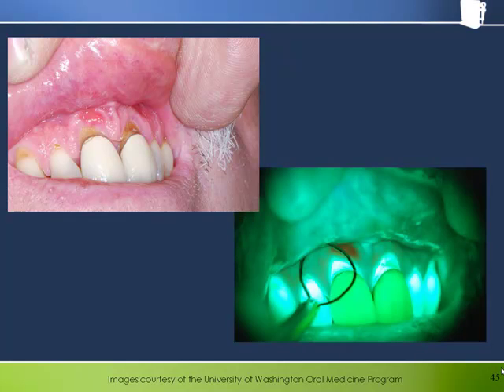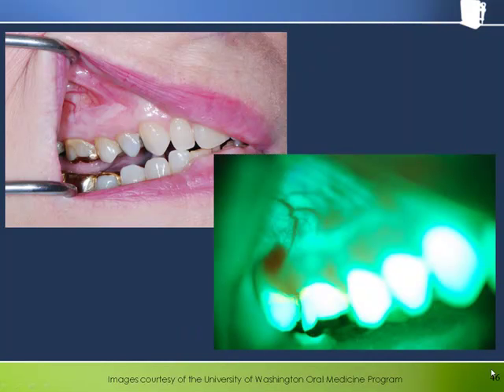Here is a troublesome looking area on the attached gingiva that has an intense loss of fluorescence through the Velscope. The red-orange hue to the color may be indicative of some bacterial presence. The area was found to be dysplastic on biopsy. It can be seen that it is the dentin that gives rise to the intense fluorescence from the teeth. Another example of an ominous looking area in gingival tissues shows the dramatic appearance through the Velscope and a large blood vessel that seems to be feeding the abnormality, also found to be dysplastic upon biopsy.